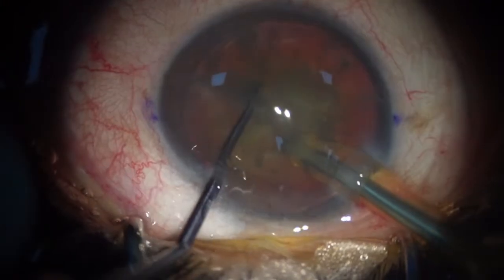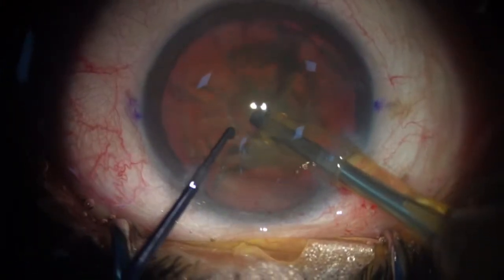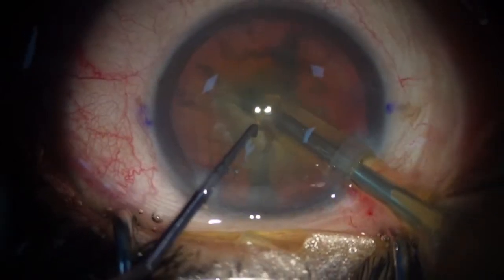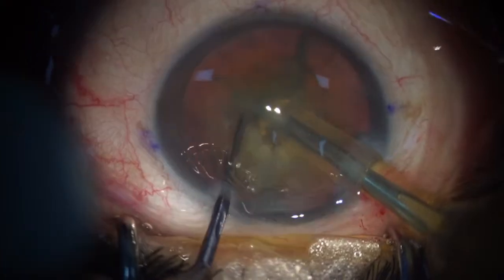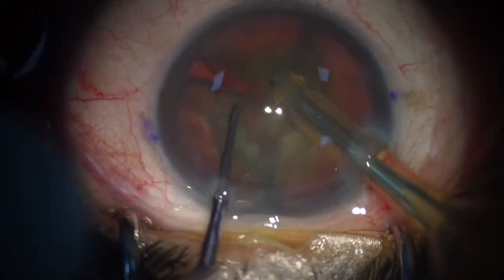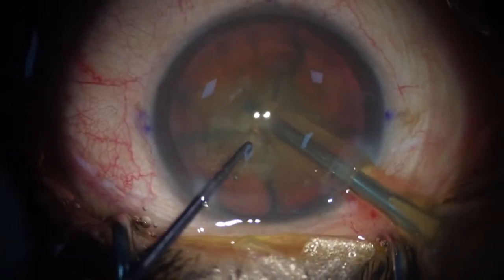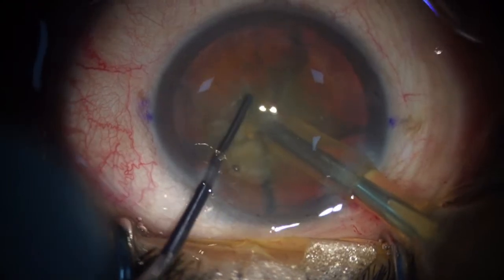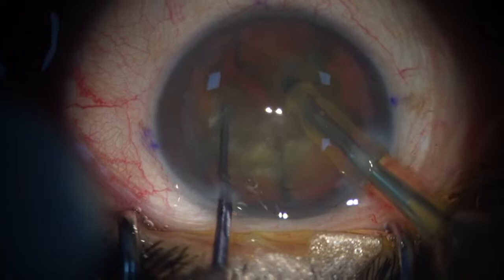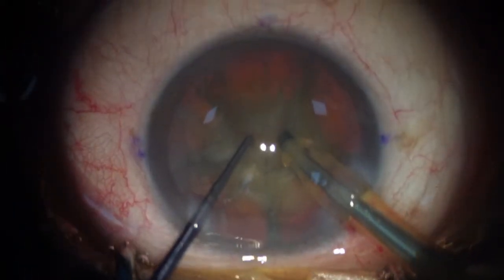So you have to be careful that if you use a very high bottle height, your lens will be pushed back. Bimanual IA systems are made to the same gauge, 22 gauge. Here I've used a 23 gauge side port because 22 was not available immediately. So I might have tight ports for my bimanuals. I may have to enlarge it. But frankly, when your instruments are all calibrated to the side ports, like the bimanual and your chopper and everything, it makes things much better.